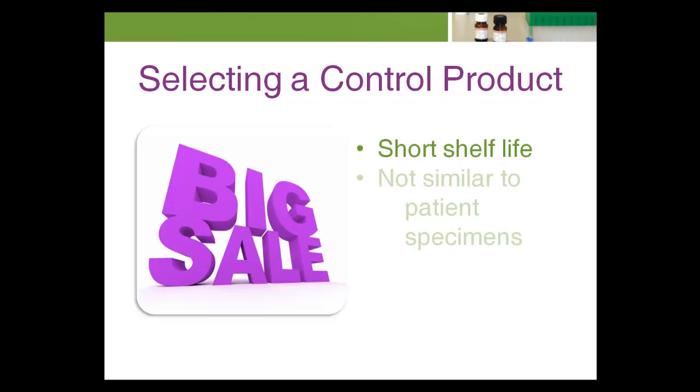Other products are not sufficiently similar to patient specimens, serum, urine, spinal fluid, or plasma. This can cause some problems with certain test systems because these products do not interact with the test system in the same manner as a patient sample.